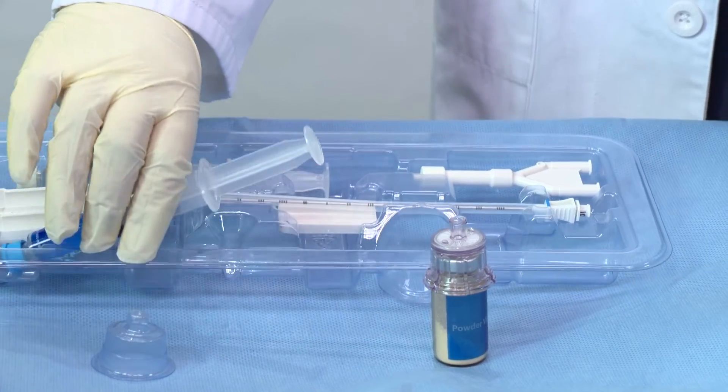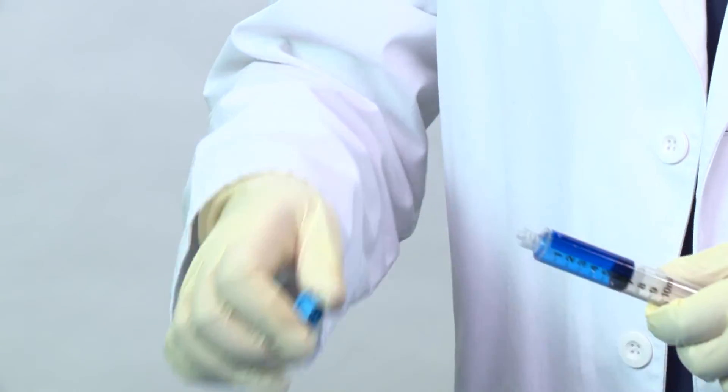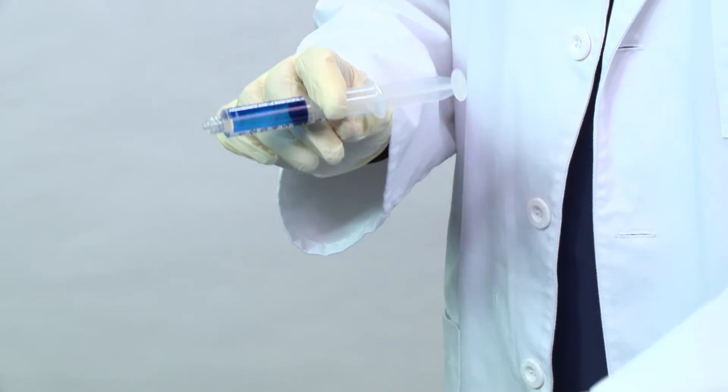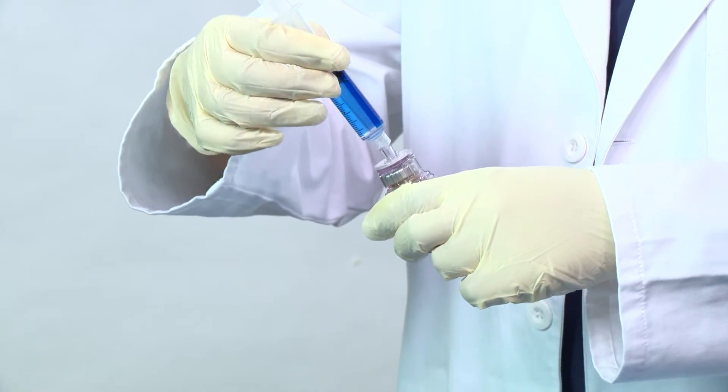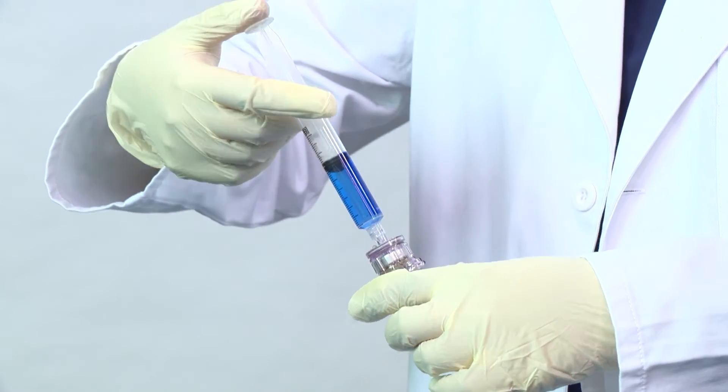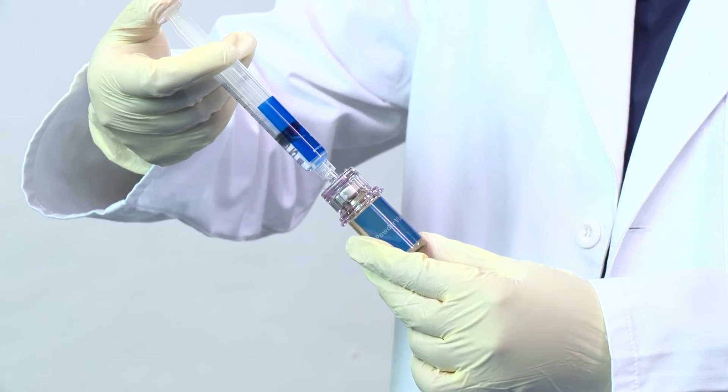Remove the blue cap from the diluent syringe and discard. Attach the diluent syringe to the powder vial. Inject syringe contents into the vial.